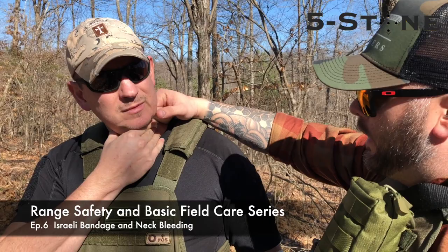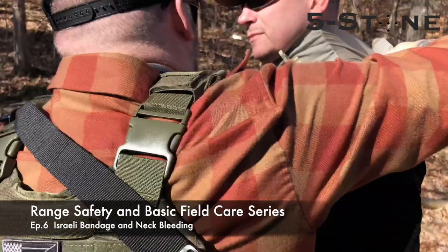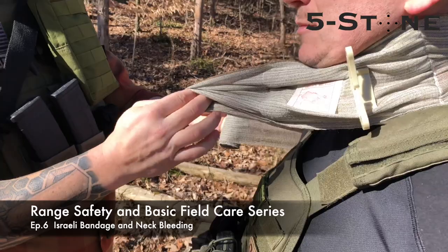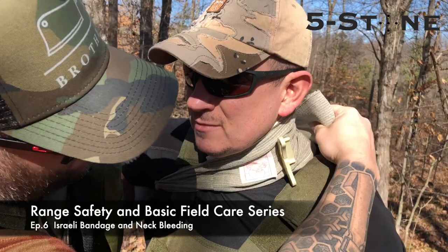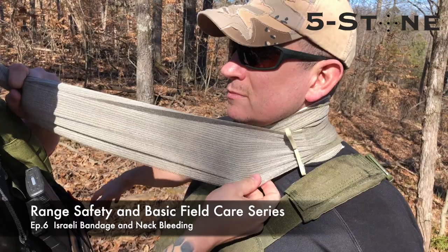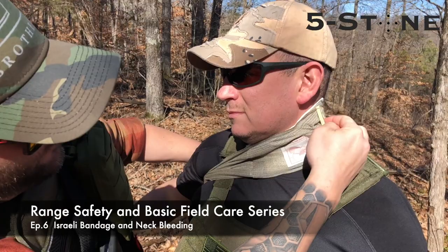Your patient, if he's still alert and able to help himself, he can help you. Get this gauze right there. Basically, I want to bring it behind his back here and try to get it with my other hand. Then I've got it right here at this position. I want to put this roll through that loop right there — try to keep that bandage on his neck. You want to pull it tight like a belt. So just keep wrapping it around his neck just like this, and pull it through this little loop right there. That's like a little alligator clip. Once you get it through that, that's going to be your pressure point. You want to pull it back again — that buckle right there puts a lot of pressure on that wound.